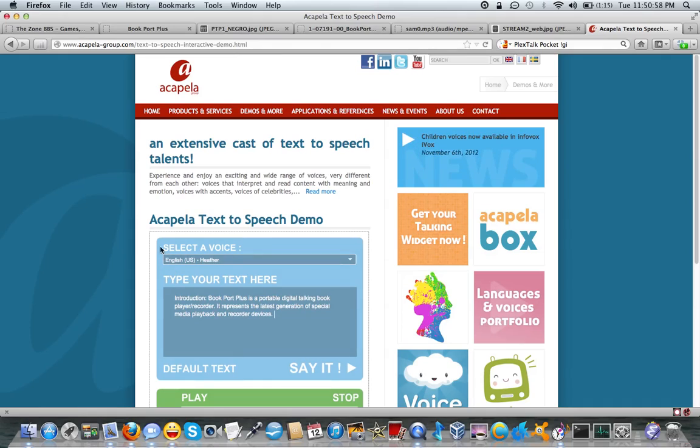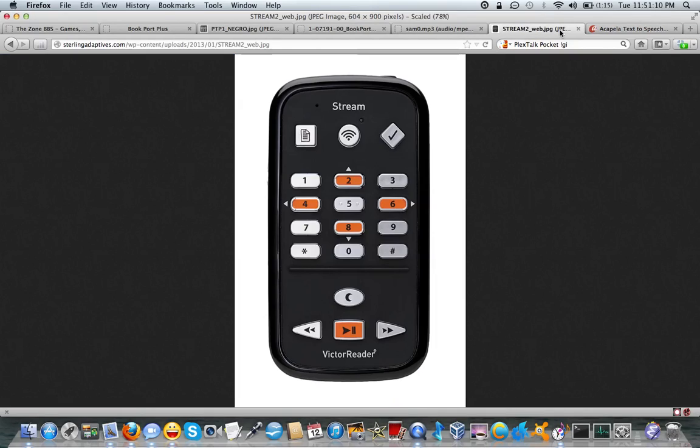So I'm not going to, obviously I didn't type in the whole thing, but you get the idea. You've heard the exact same thing read from the BookPort Plus and the VictorReader Stream. So the Stream also, from what I understand, has better battery life at 15 hours. Okay? It does not have the enhanced recording features, however.